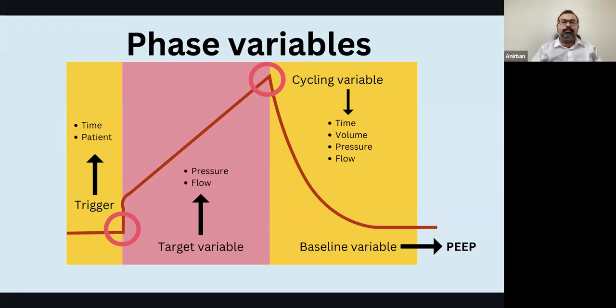This is done mainly when the patient is sedated, paralyzed, has very little of his own respiratory effort, or is intraoperative or immediately post-operative. That is when the patient does not have his own trigger, and that is when time triggered breaths are given, so that every 5 seconds a breath is given by the ventilator. If the patient has their own respiratory effort, most often they are kept on patient triggered.